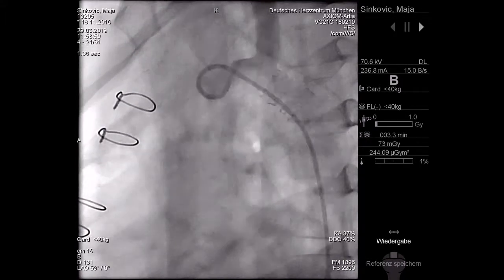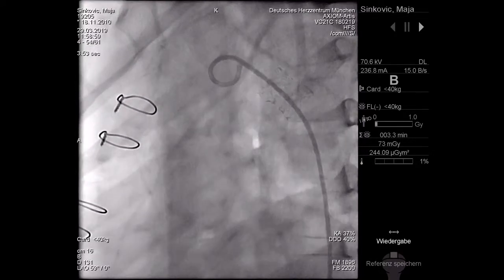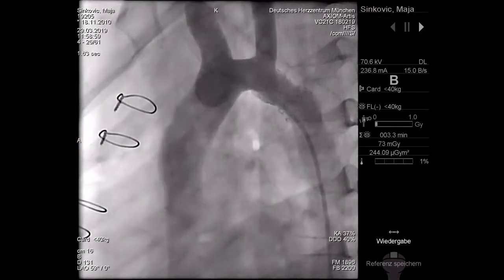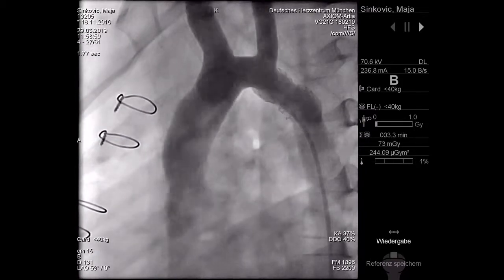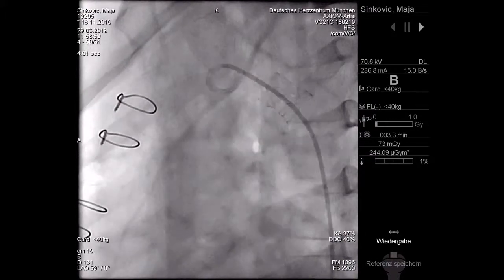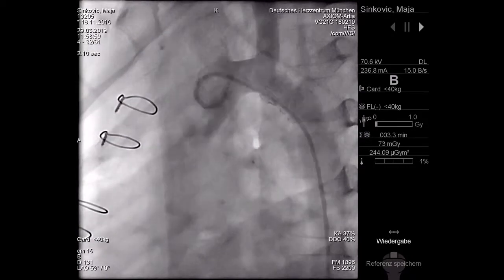We have the impression that some struts are already broken, and if you have a closer look at the proximal edge of the stent, at the inner curvature, then you see there's obviously a small dissection as well. The dissection in the caudal portion at the other end of the stent is completely stable. There were no alterations, and the subclavian artery still is open.